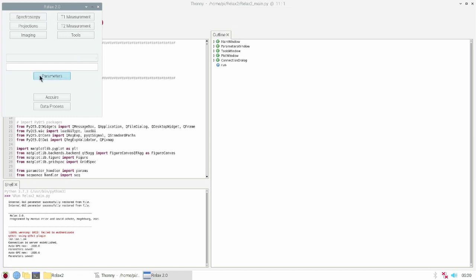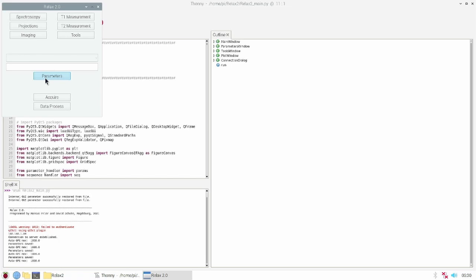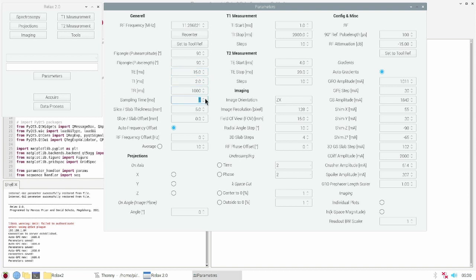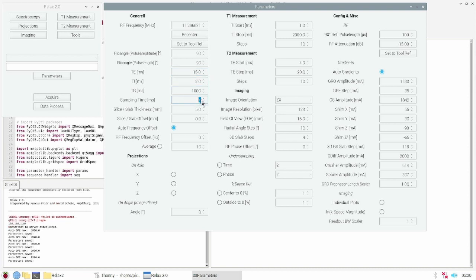To check my MR parameters I click on parameters and open the parameter window. Here I can set the TE time to about 15 milliseconds and the sampling time to 6 milliseconds.